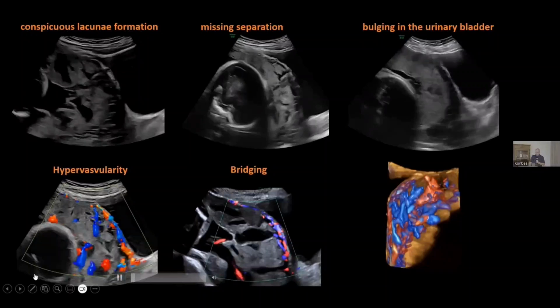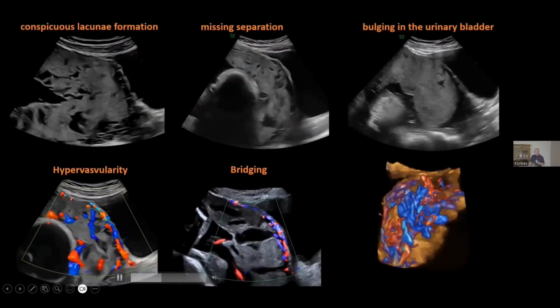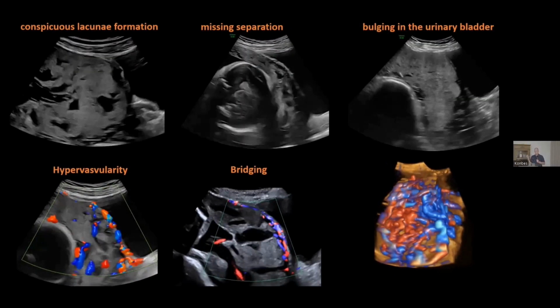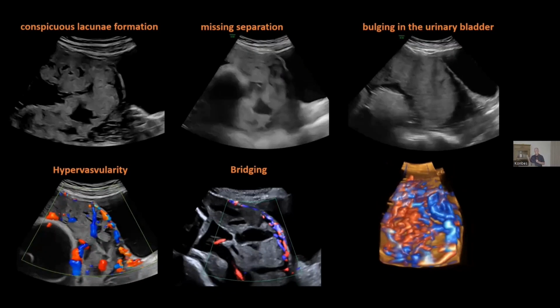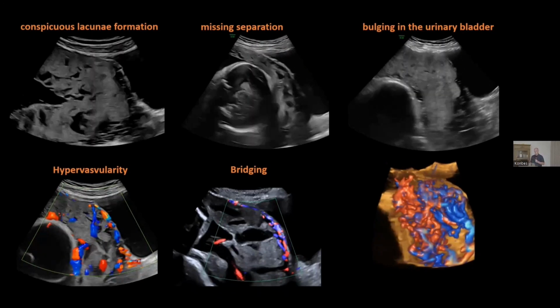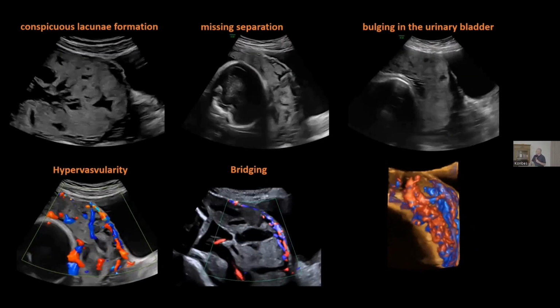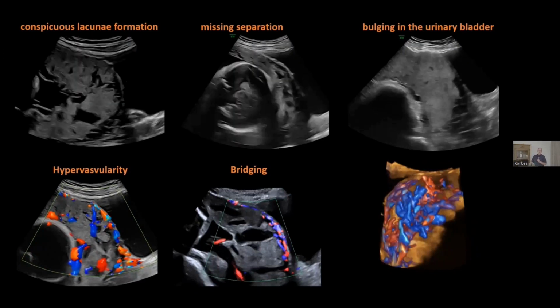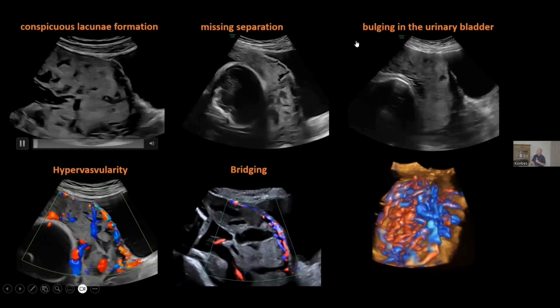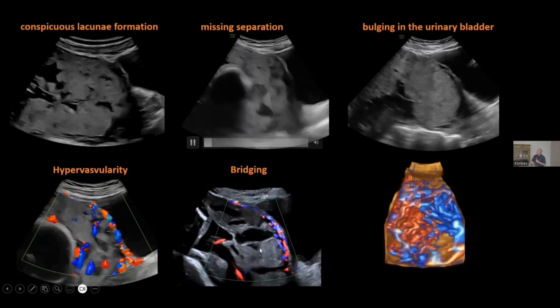We can do it also by 3D ultrasound, but I think it's more toys for boys, or it gives more information. It makes fun, and we can try to make some interesting new pictures, and we have to decide if it's helpful or not. But to my mind, we should concentrate on the other findings we see in the above images, and also on the vascularity.